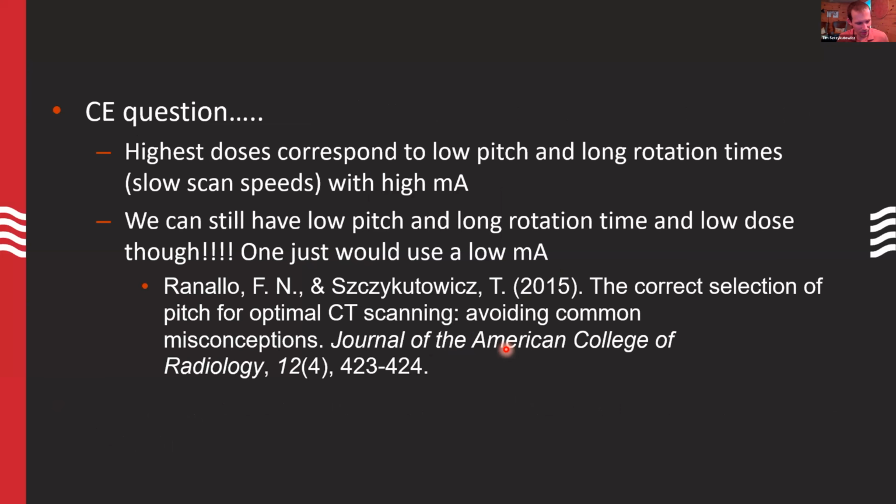So one of my colleagues and I wrote a paper a handful of years ago just to talk about this, that yes, you can use a low pitch, and it's not horrible for the patient in terms of overdosing them. You're just going to be using a lower mA station. So you really shouldn't think of pitch as your primary dose knob. If you are thinking of that, maybe you were trained before automatic exposure control was a thing. But nowadays on a modern system, the scanner can usually pick an mA value that's going to allow you to use a lower pitch if you wanted.